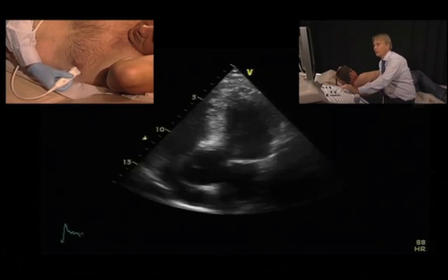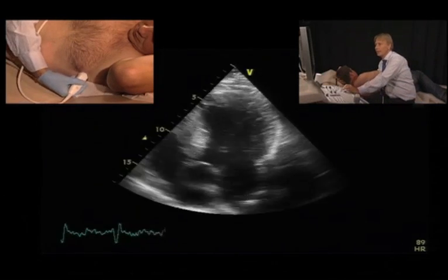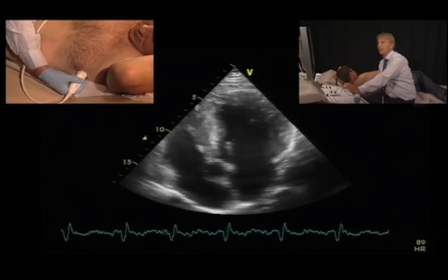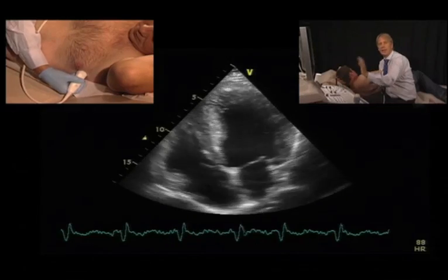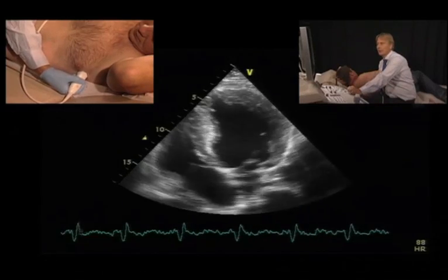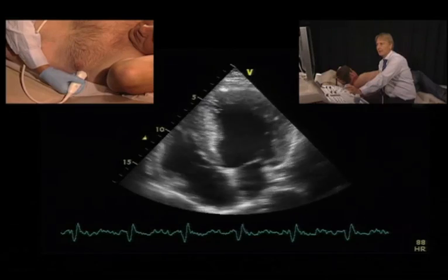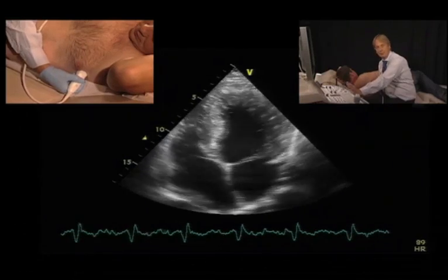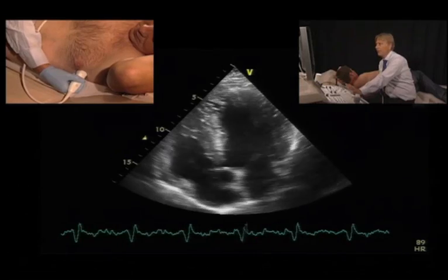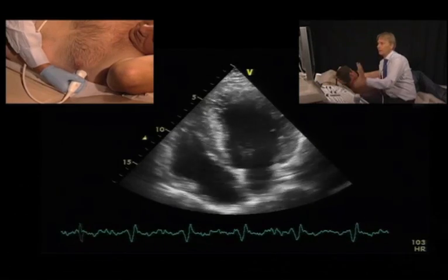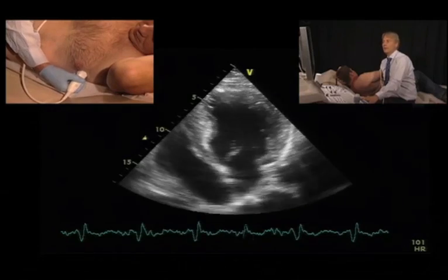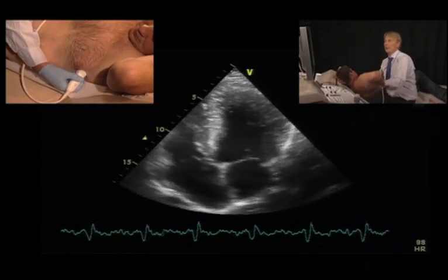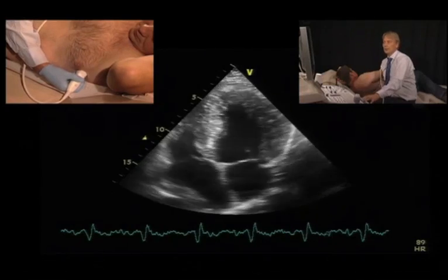But there are also other ways of looking at this patient's diastolic function. Just by purely looking at the 2D image, you can recognize that the patient has severe left ventricular hypertrophy — hypertrophic cardiomyopathy. Such patients simply cannot have normal diastolic function. So clearly, all you would need is the 2D image.